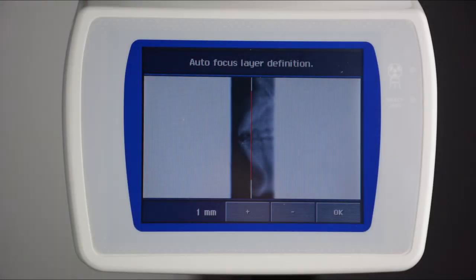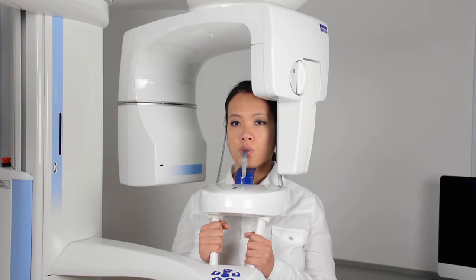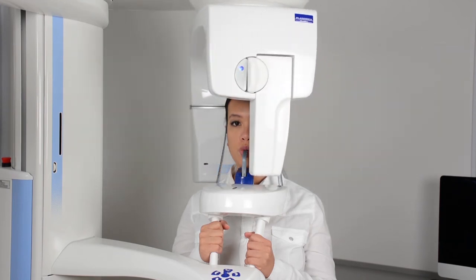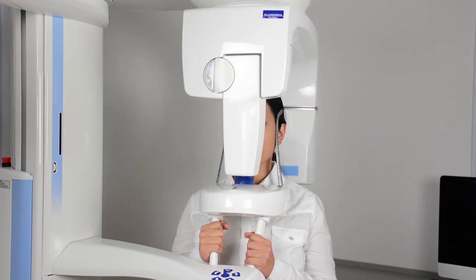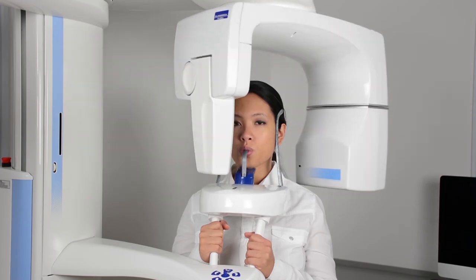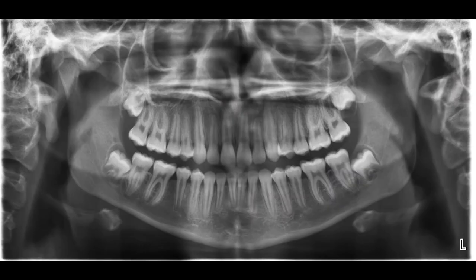Once the image appears, press OK on the ProMax, then press and hold the exposure button again until all audible noises cease. The image will appear in real time on your computer screen. If your imaging software requires you to save the image, press OK or Done where applicable.